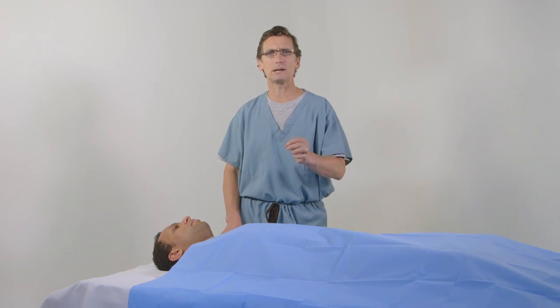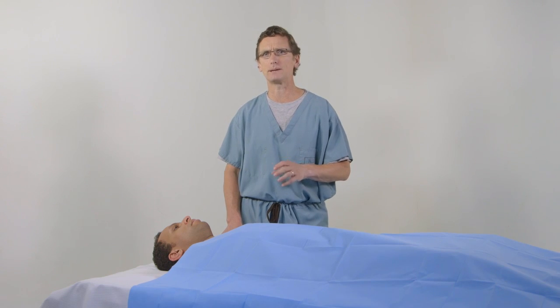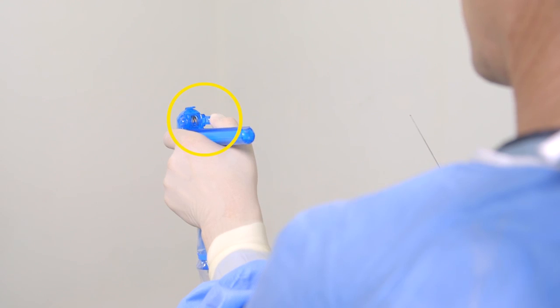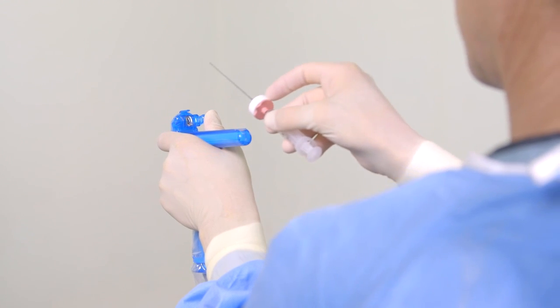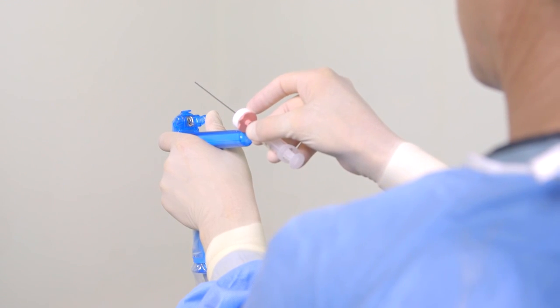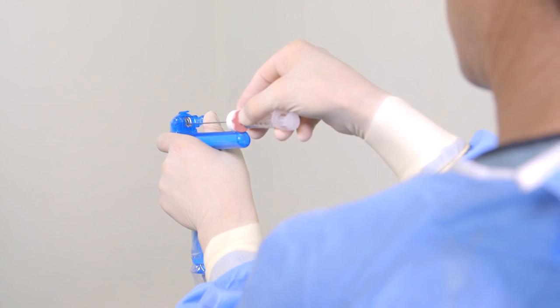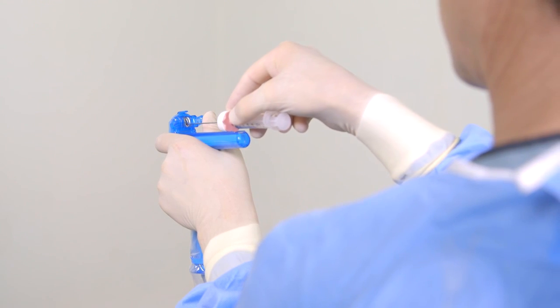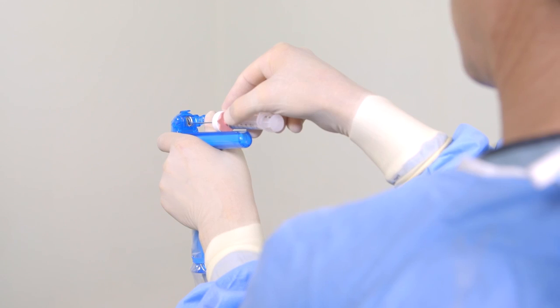It will be necessary to increase the depth of view deeper than you would for an internal jugular vein cannulation — I usually set it between 5 and 6 centimeters. Start preloading the needle by rotating the needle clamp fully forward with your thumb to the open position, such that the needle guide opening is unobstructed. Then place the magnet against the proximal end of the magnet rail to stabilize the needle as you move the needle tip into alignment with the needle guide opening. To maintain needle sharpness, avoid hitting the needle tip against any surface as it is preloaded into the needle guide.